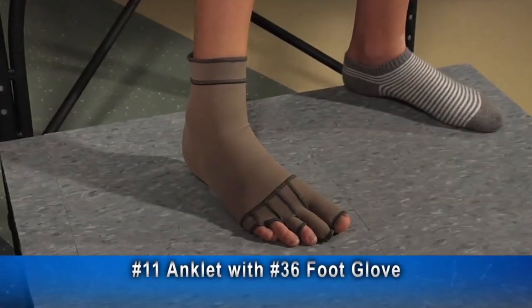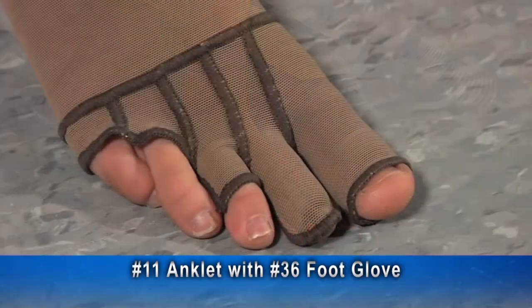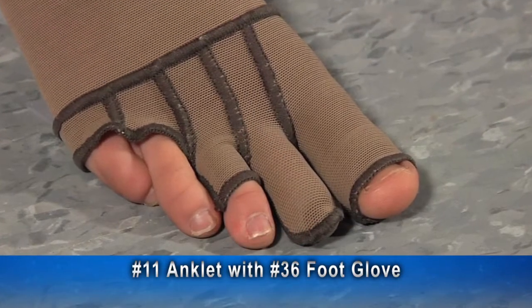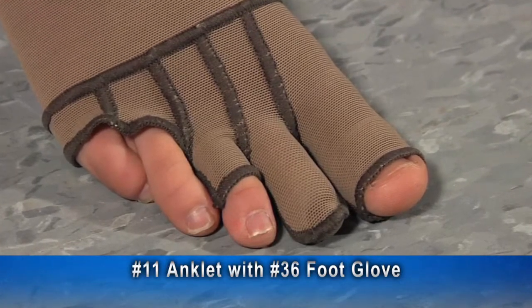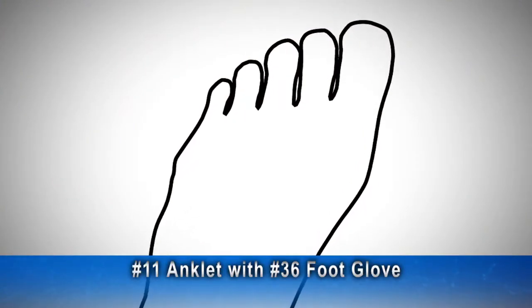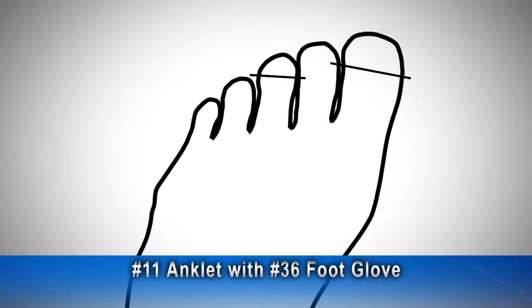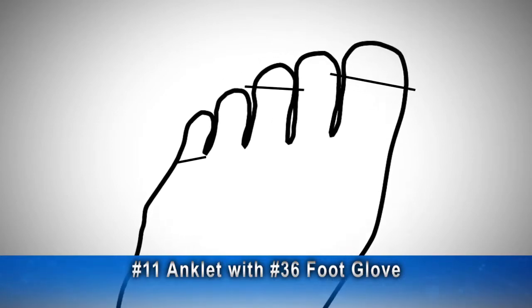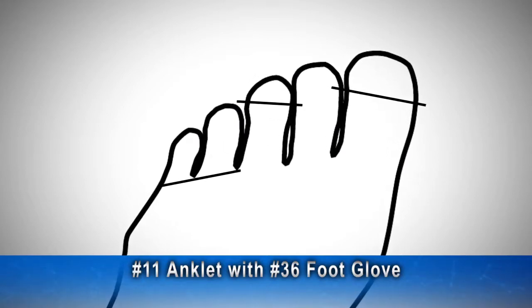Here is a number 11 anklet with a number 36 foot glove attached. This foot glove has a common opening for the 4th and 5th toes. The 1st and 3rd toes are open. The 2nd toe is closed. On the foot tracing you would send with these measurements, the first and third toes would have lines across them to indicate the desired openings. A line under the fourth and fifth toes would indicate the common opening, and the second toe would have no lines.